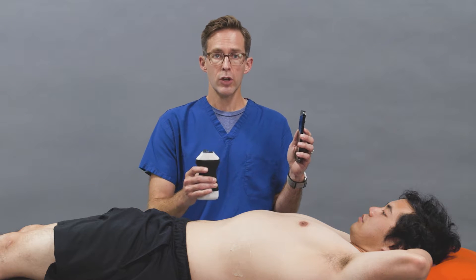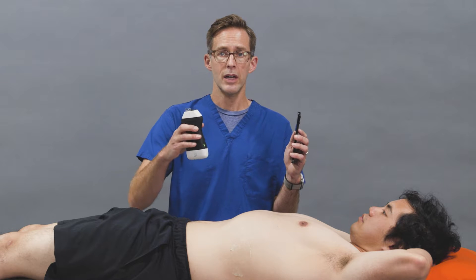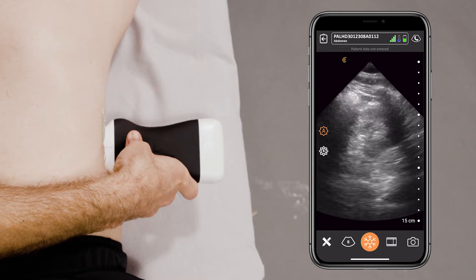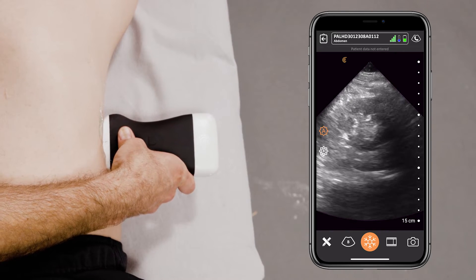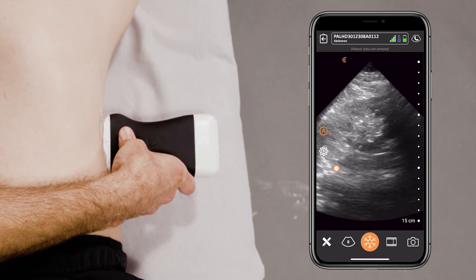You can do either kidney first. I like to do, to be honest, the left one, which is sometimes a little more difficult to find. What I do is put the probe in longitudinal orientation and basically do almost like a FAST view of the perisplenic region. But instead of the spleen, I'm really looking at that kidney, which you're seeing here.